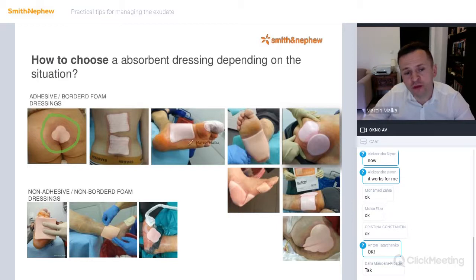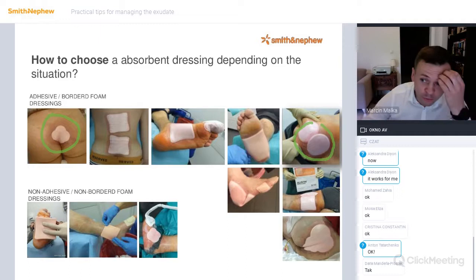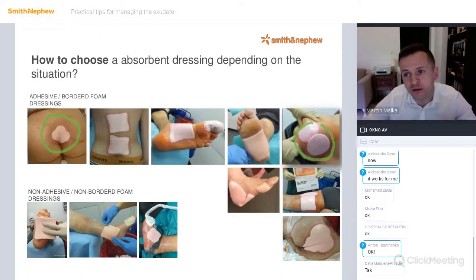And also for the shoe, Allevyn Gentle is very flat, so it's easier to use on a plantar area. I mean for mobile, active patients. Allevyn Adhesive, 17.5 centimeter. Why? It's very popular in Poland, this kind of dressing. Allevyn Gentle Oval, Allevyn Gentle Light Oval. It's the light form of Allevyn Gentle Border for the last part of our healing process, for epithelialization. There is no big capacity for exudate in these dressings, but it's good to promote epithelialization and finish this epithelialization period.